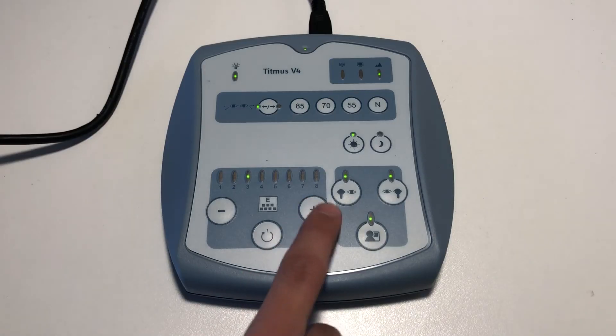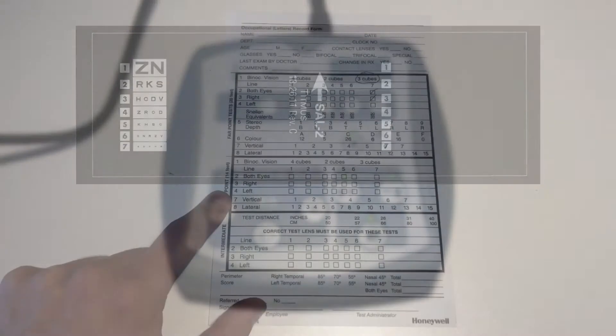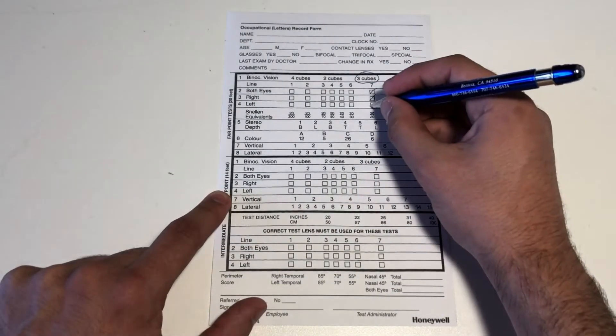Advance the slide to number four. This slide is the same as the previous, but for the left eye. Mark the results in the left answer box under far test.